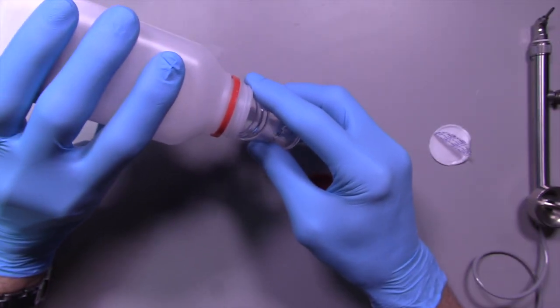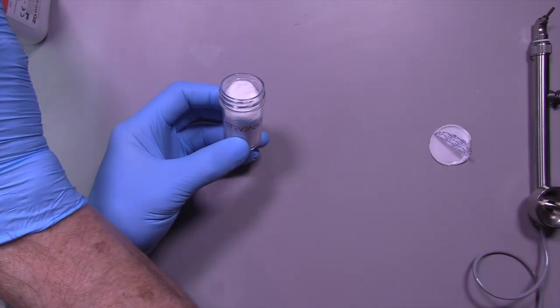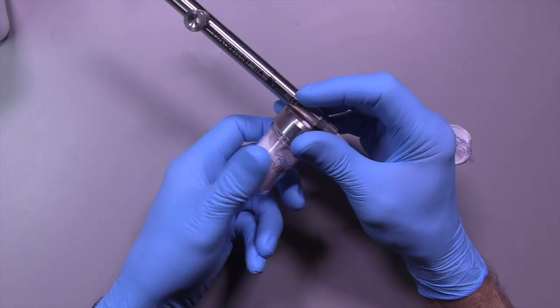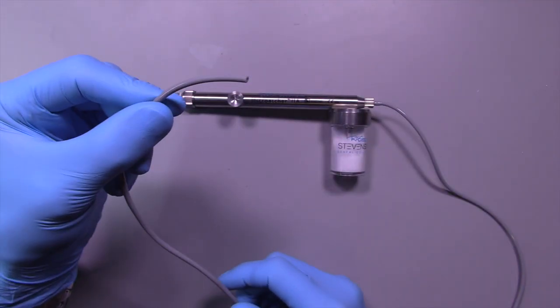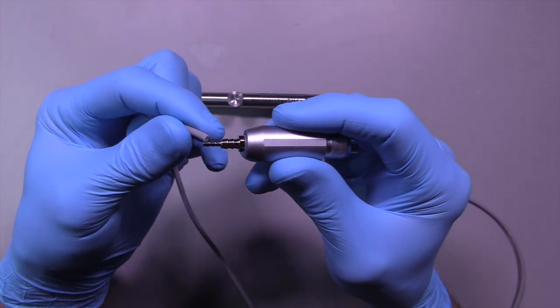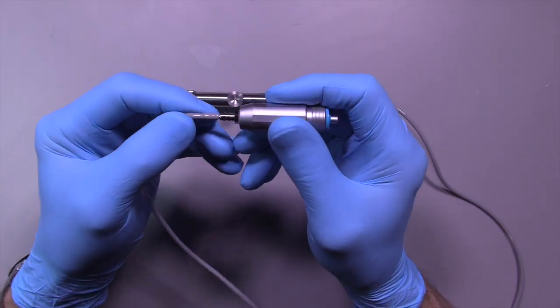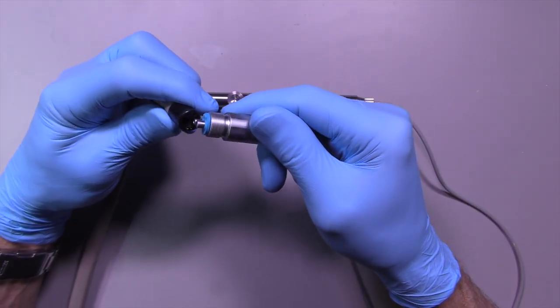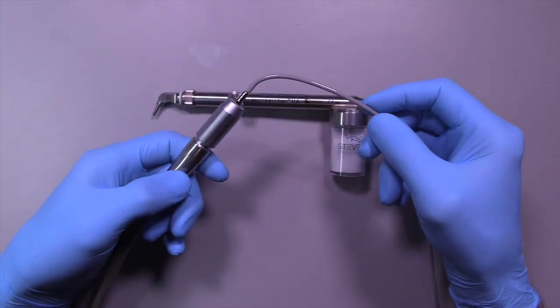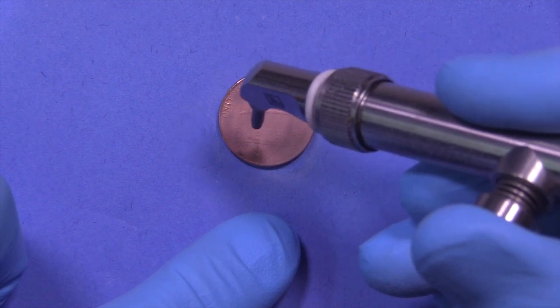It's great for cleaning out debris in restorations before you cement them. In the case of the immediate dentin sealing technique, we need to lightly sandblast the surface that we sealed in the previous step. Let me show you how easy this is to use — I'm going to take a U.S. penny and go over the surface, and you can see how quickly this removes the luster off the coin.